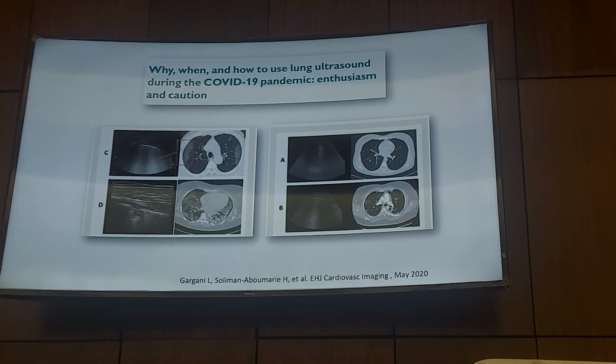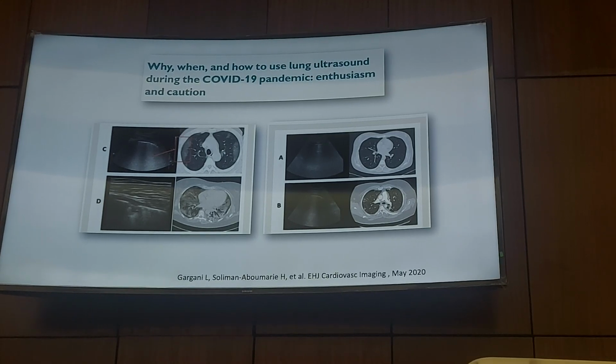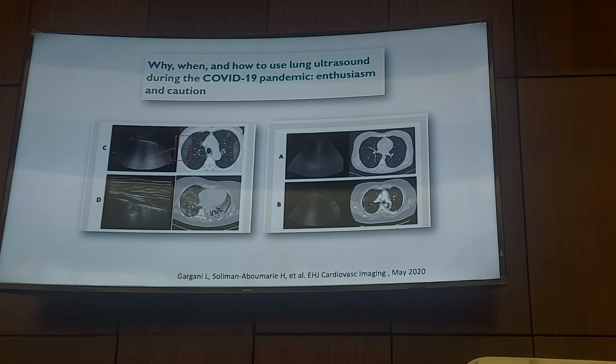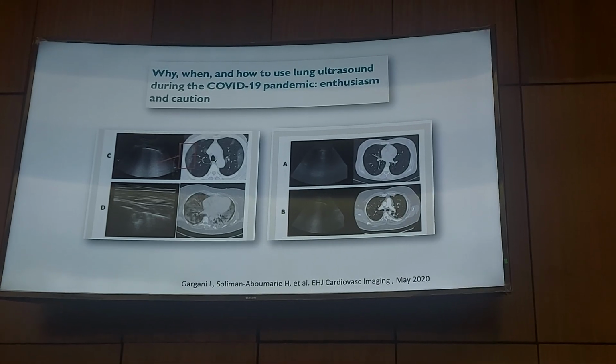First, clinical approach, clinical context. Second, with ultrasound, you can have clues. The pleura in heart failure is usually thin and healthy. If you see the pleura thickened and irregular, that is an indicator of inflammation.